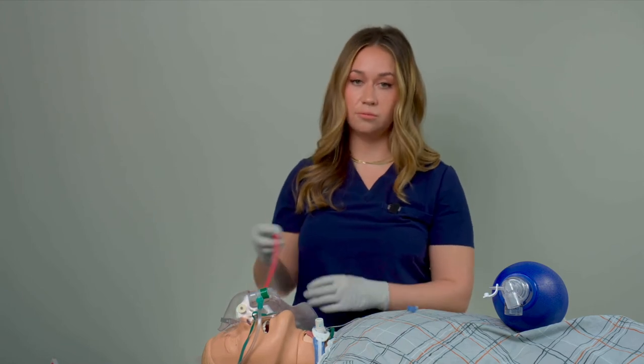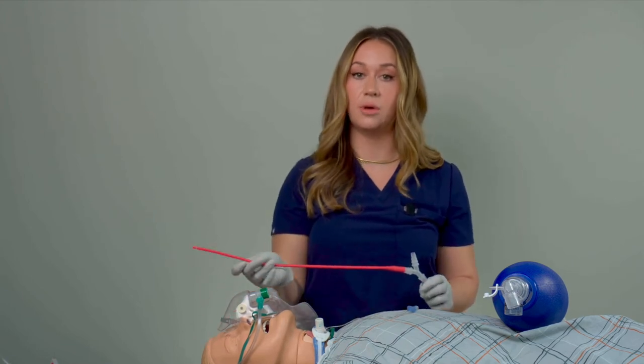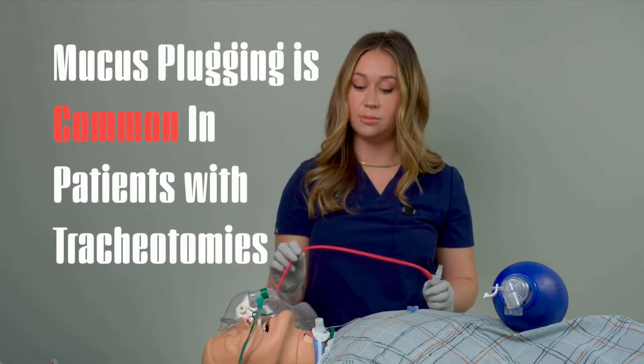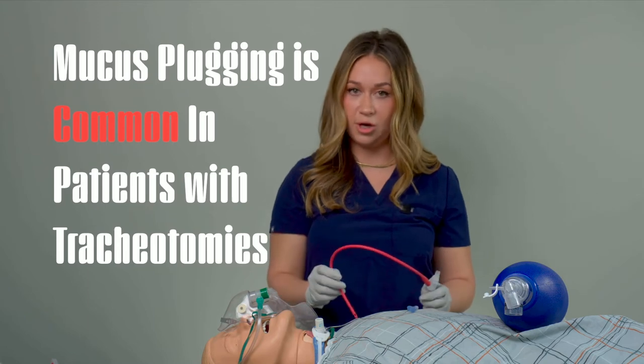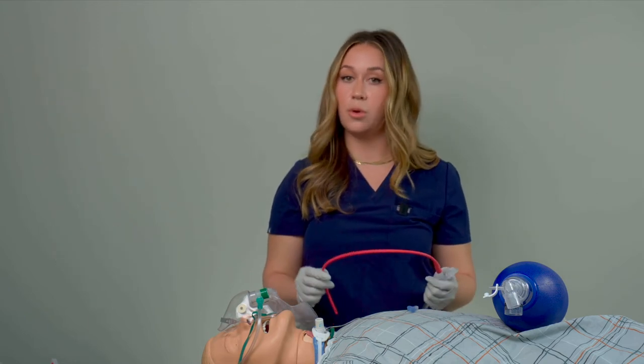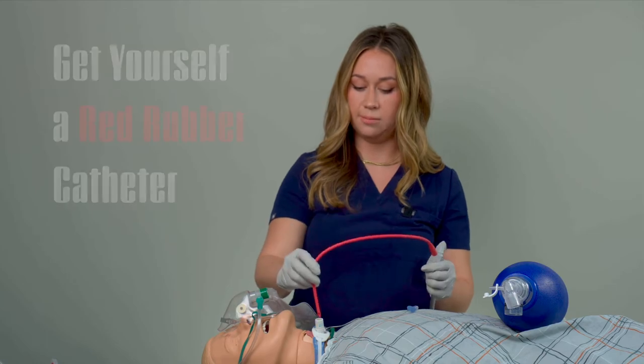The most common cause of respiratory distress in a patient who has a tracheostomy is obstruction of the trach. So the next thing that you're going to want to try and do is suction the trach.